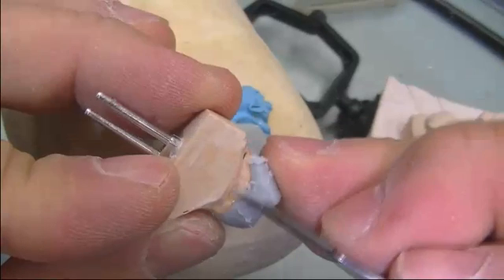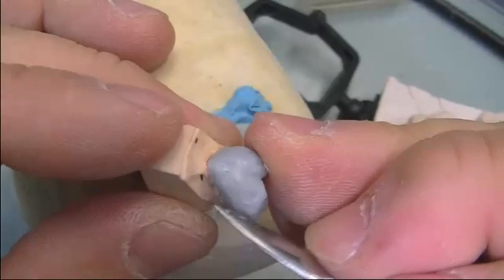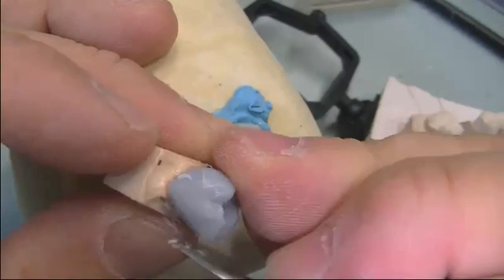We'll take the carver and smooth out the surface, then reduce any excess bulk.